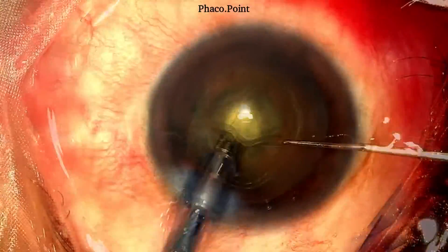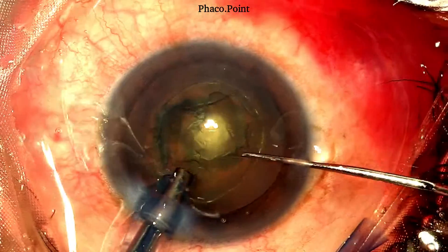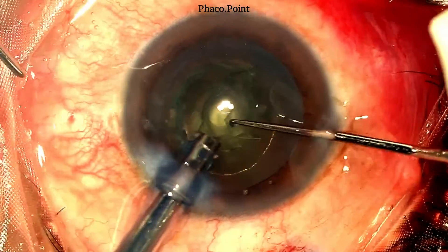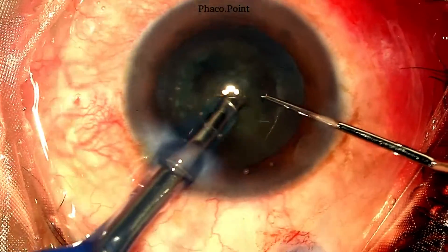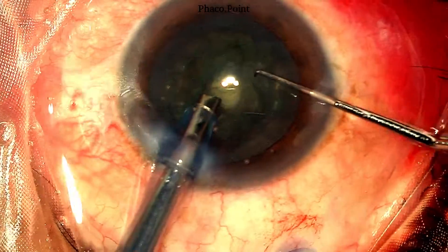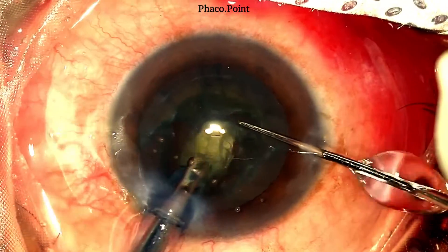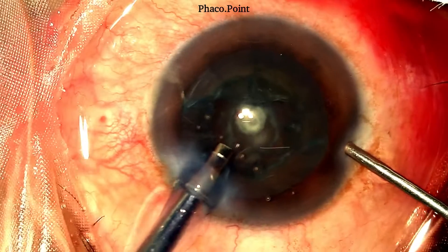We now move to nucleus emulsification. It is an extremely soft cataract and the plan is to just hold on to the endonucleus, bring it up, and aspirate it. Almost no energy would be used. The settings would be something like a power of about 20%, a flow rate of 25 cc per minute, and a vacuum of 300 mmHg. Despite the optimal settings, it was a little bit of a struggle to hold on to this very soft nucleus and bring it up — with care, caution, and patience, you will be able to do so.